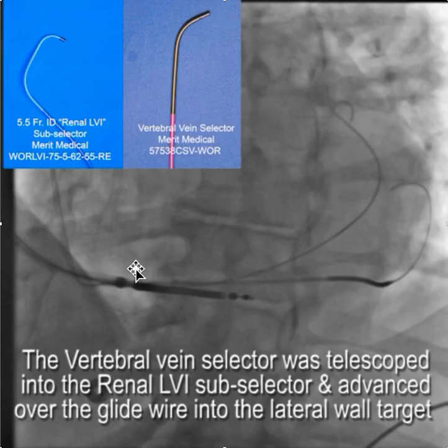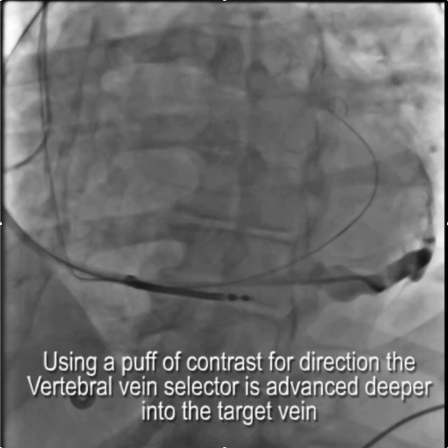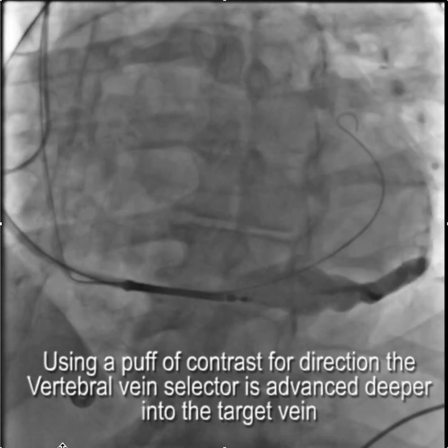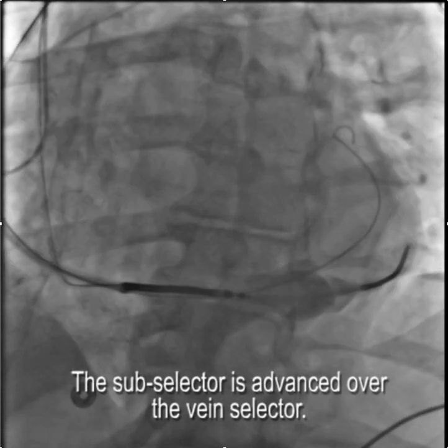From there, we combined the vertebral vein selector, telescoped it inside the renal LVI subselector, and advanced the combination over the glide wire and into the coronary sinus. Then to be sure we were where we thought we were, we took the glide wire out and puffed a little contrast to look for the side branches and what this big lateral wall branch looked like. Here we are in the LAO projection — so it's clearly a lateral wall branch.